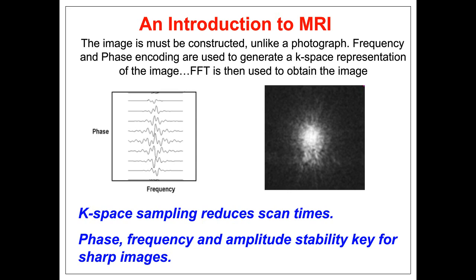And this is a very interesting part of MRI that's out of my area of expertise, and that is the image processing that's involved. But if you have, for example, a 1-second pulse repetition rate, which still would let you pick up the image even though it has decayed for quite a while, and you have a 256-line K-space representation, each line you have to fill up 1 RF pulse at a time.